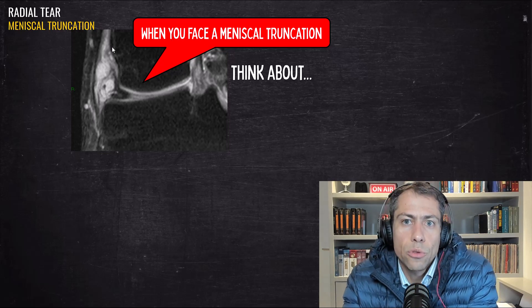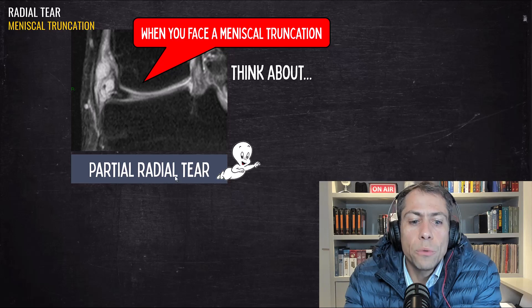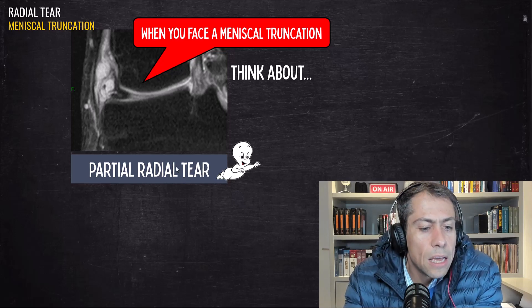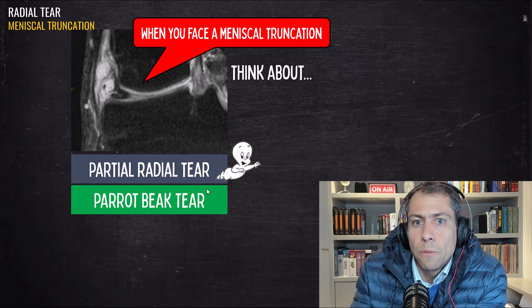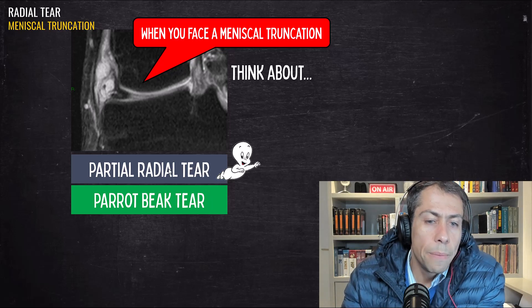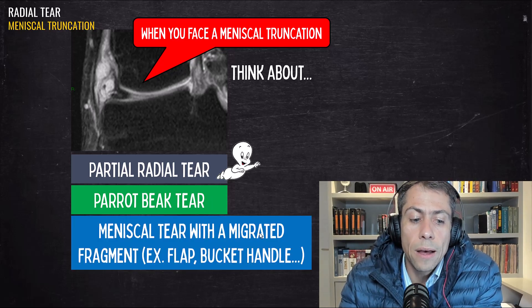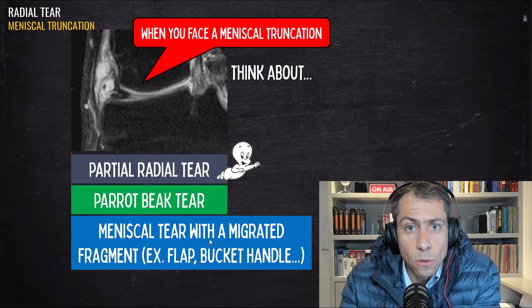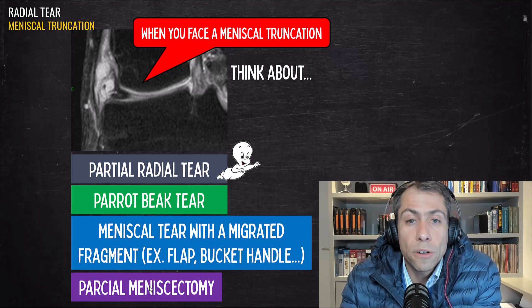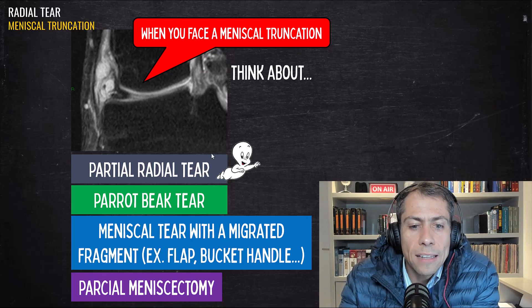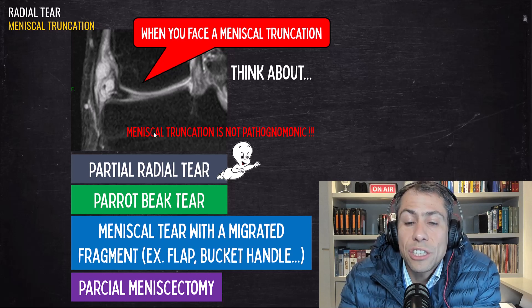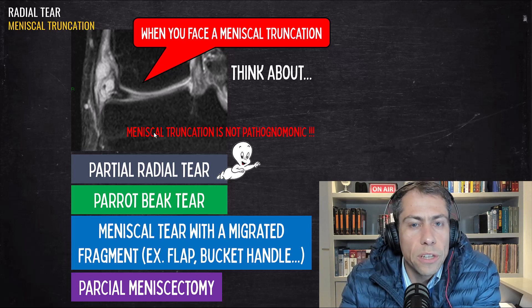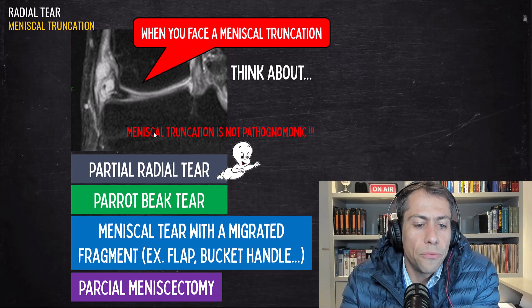When you face a meniscal truncation, you have to think about a partial radial tear — the Casper sign — but you also have to think about the parrot beak tear, which is a radial oblique tear. You also have to think about a meniscal tear with a migrated fragment, a flap, a bucket handle tear, and post-surgical alteration such as a partial meniscectomy. Remember that meniscal truncation is not pathognomonic of a partial radial tear; there are different pathologies that can generate this truncation.